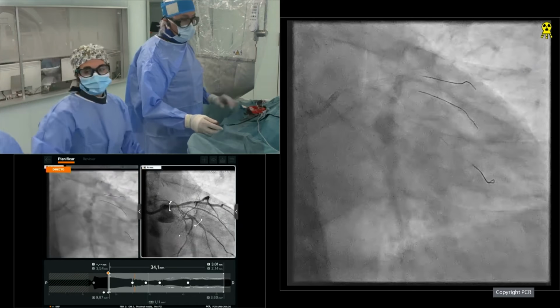Javier, can you anticipate your stenting strategy? Are you going to place one stent crossing over from left main to circumflex? Provisional? That's your strategy? No, Nieves and I discussed that the best possible strategy will be to make a crossover stent. Certainly it is our standard practice in any ostial circumflex stenosis, for many reasons: because it is more effective, because it is safer for the future if anything has to be done, and because we do not believe it has any major intrinsic risks. It is not really left main PCI.